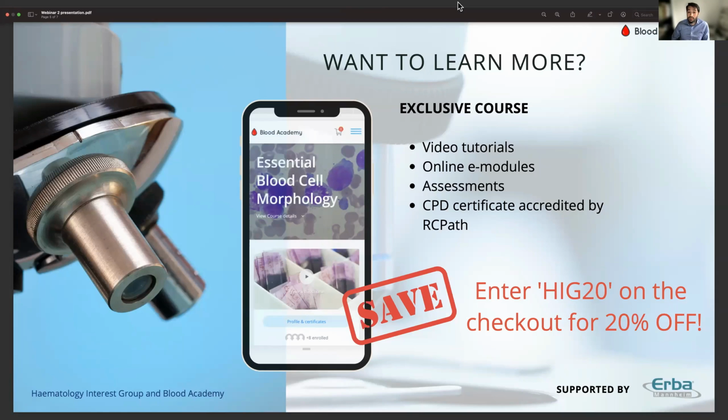This webinar series is providing you with an introduction about blood cell morphology. We've got some really excellent speakers from all around the world.